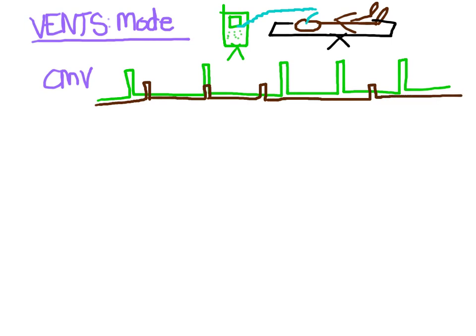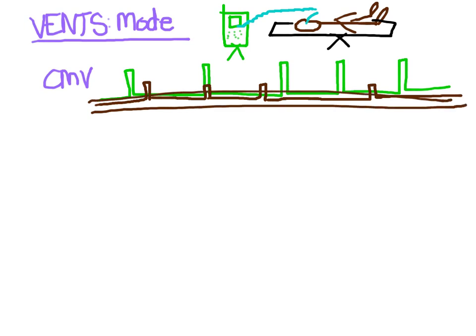So you can see that these two are moving independently. Whatever the patient does is ignored by the ventilator. And so this mode is really only useful for patients who are completely out of it, paralyzed and sedated. Otherwise, it's just too obnoxious to be given these huge breaths when you're not expecting them and to try to breathe against the ventilator. And so we don't really use CMV anymore. Actually, the one that we do use is something called assist control.